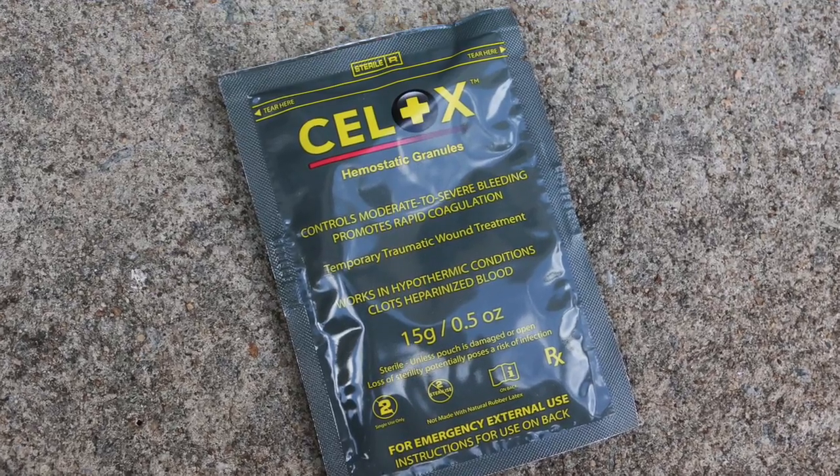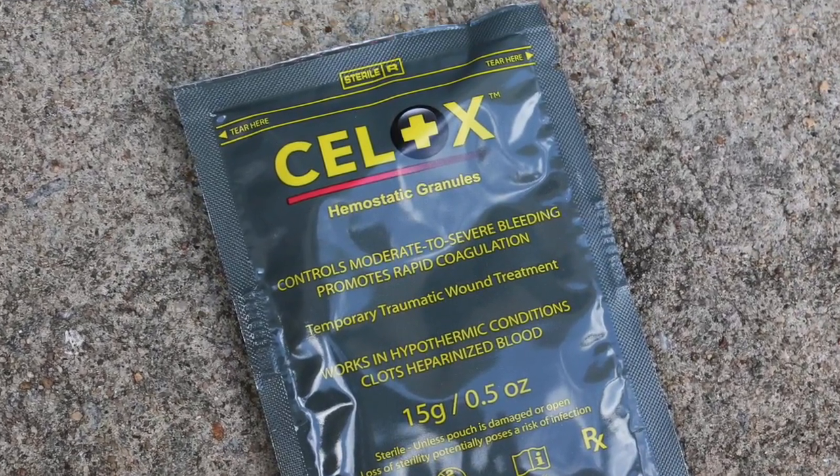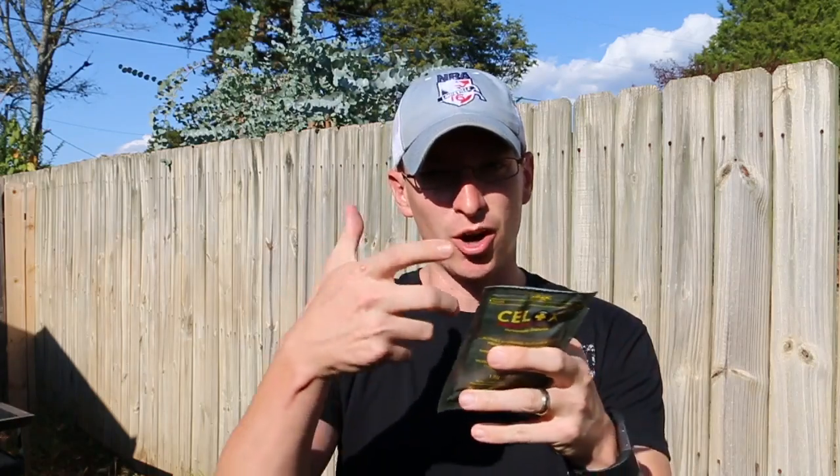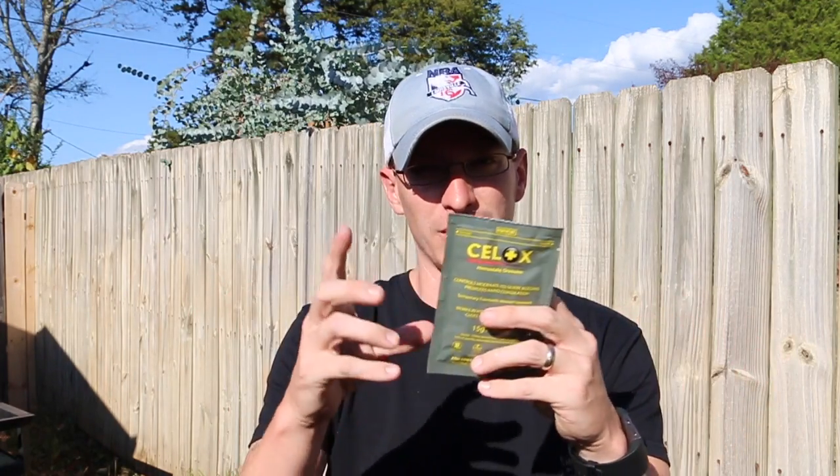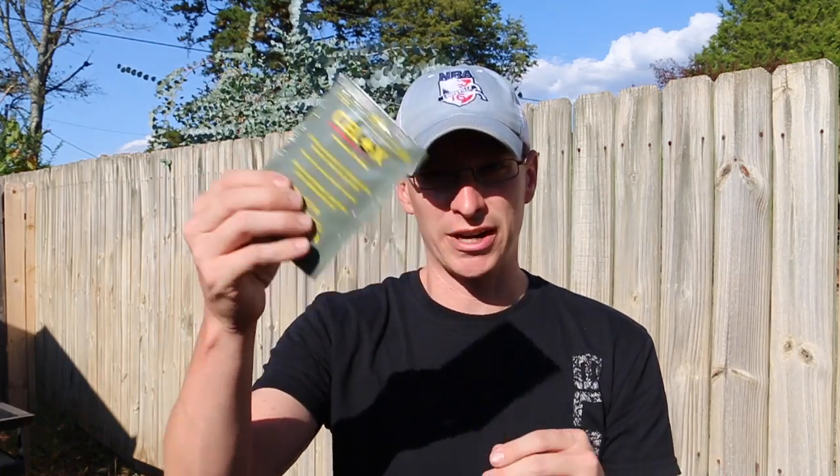This is the granular version here. They do have an applicator as well that you can buy that has it already inside of it — I've done a video on that, I'll put an annotation here for that one. They also have gauze that's impregnated with the Seelox chemical or powder on there. So you can buy either way, but this is just the granular powder here.